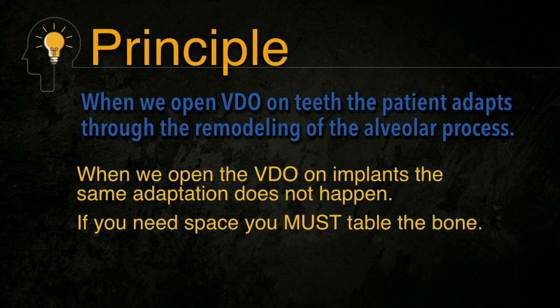When we open the VDO on implants, the same adaptation does not happen, so we must table the bone or level the bone to get the space.